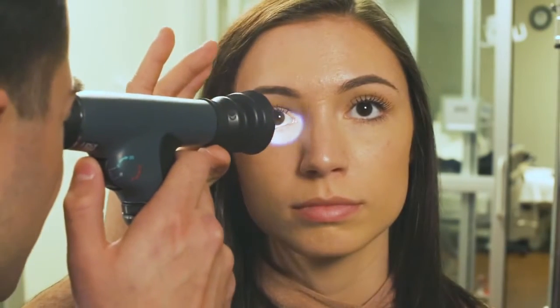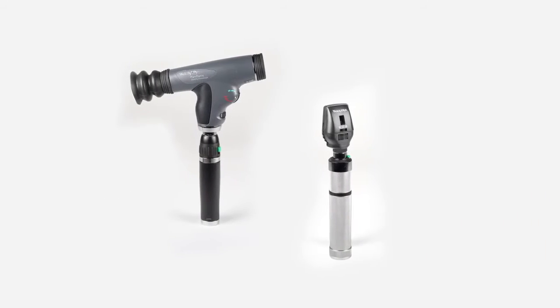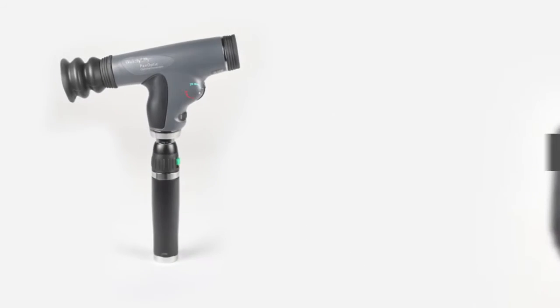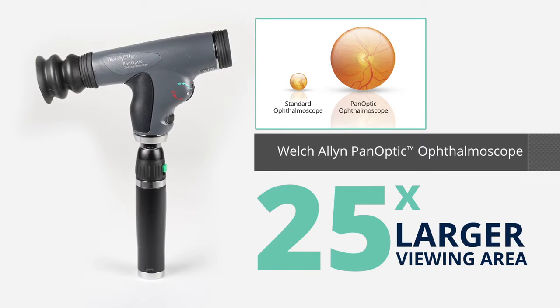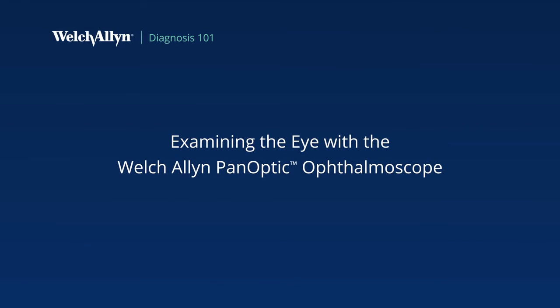When performing an eye exam, the basic steps are the same for most ophthalmoscopes. WelchAllyn manufactures two ophthalmoscopes: a traditional ophthalmoscope and the WelchAllyn Panoptic Ophthalmoscope, designed to give you a 25 times larger viewing area, helping support faster and easier examination of the eye. Now we're going to review how to use the WelchAllyn Panoptic Ophthalmoscope.